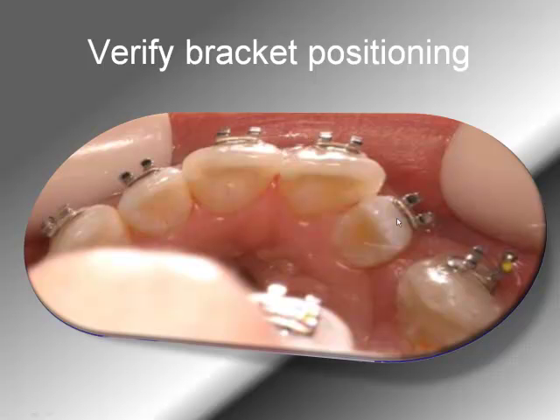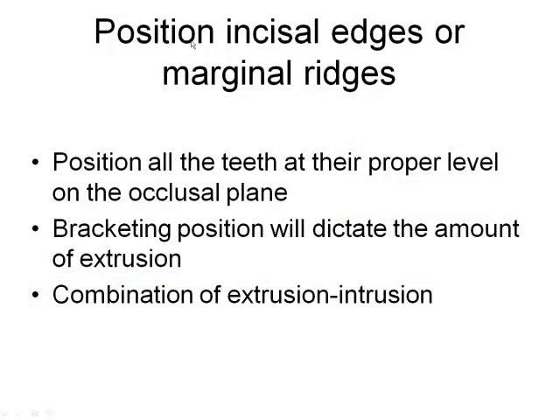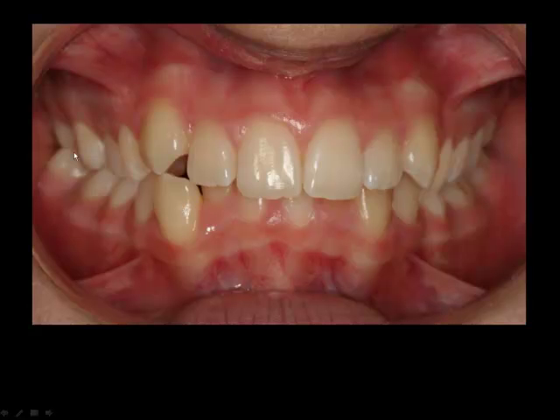Don't forget to use the curing light between each bracket. It's very important to position the incisal edges and all the marginal ridges at the right place. The best way is to get the bracket into the proper level on the occlusal plane. In this patient, some teeth are too high — the gingival margins are a little bit different, though the left side is a bit better.